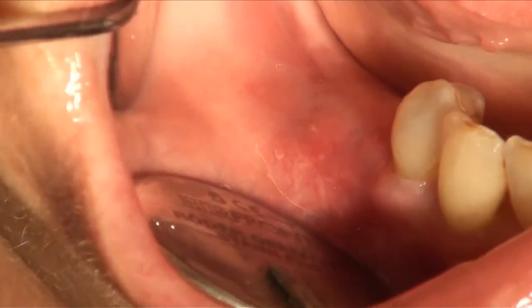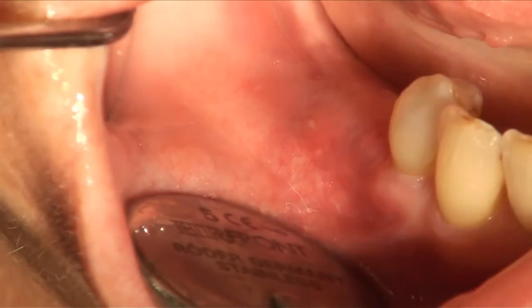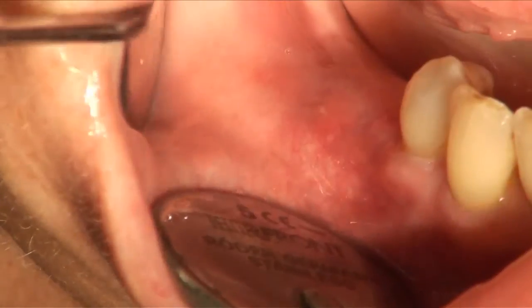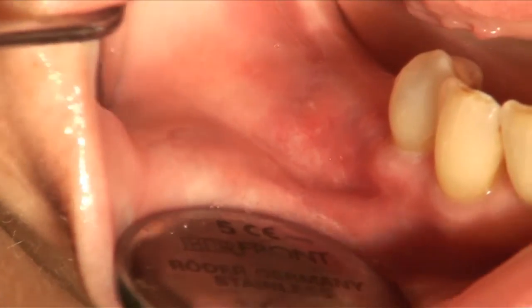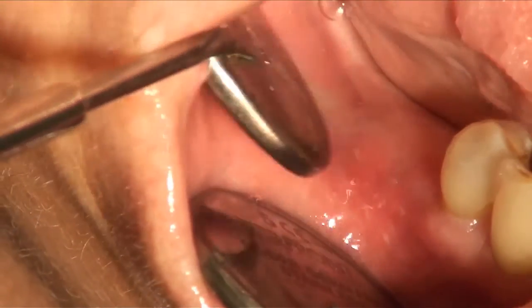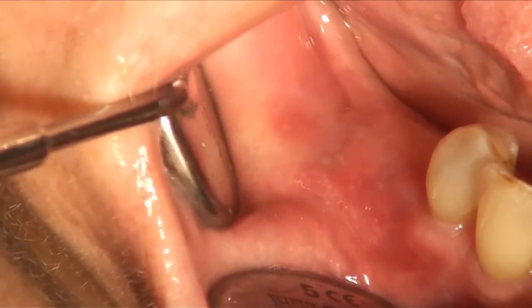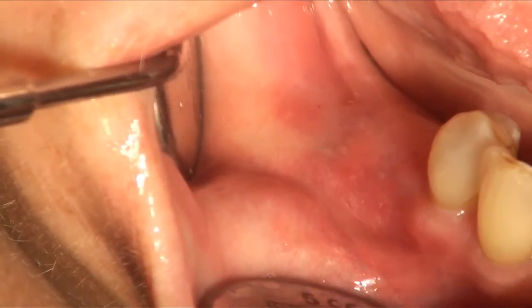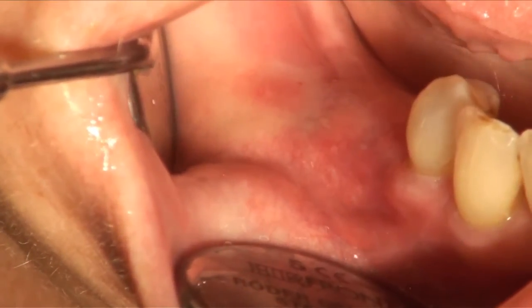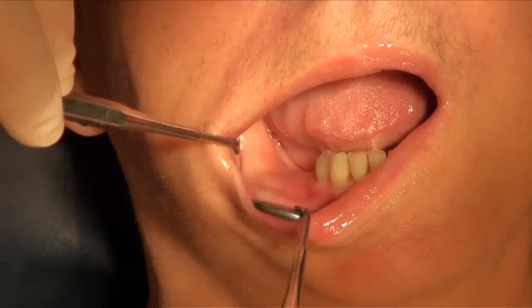Intraorally, we see now the situation with the expander inside the soft tissues, demonstrating the extension already occurred in this area in the posterior right mandible, where we will apply an autogenous bone block transplantation from the posterior side to the anterior, where the teeth are missing from number 5 on.